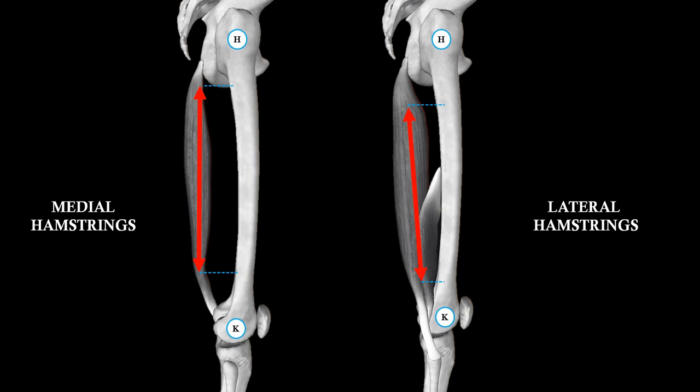And another point that we discussed during your practical session, anthropometric variables can be an issue if someone has a large amount of adipose tissue. Any structural issues, someone that's taller is going to have longer muscles versus someone that's perhaps significantly shorter is going to have much shorter muscle bellies. So you have to factor in height into your analysis, and you would possibly want to exclude people that were too short or too tall.